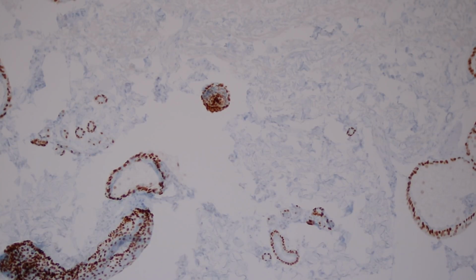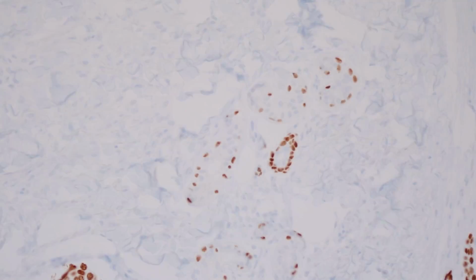And then the other thing that we can look at are the eccrine glands and ducts. And as we saw in the first video when we looked at the different types of keratins that are present, I'm going to turn the slide around. I'm having trouble driving it with my left hand again. Okay. So the different types of keratins show different staining in different parts of the eccrine secretory system.